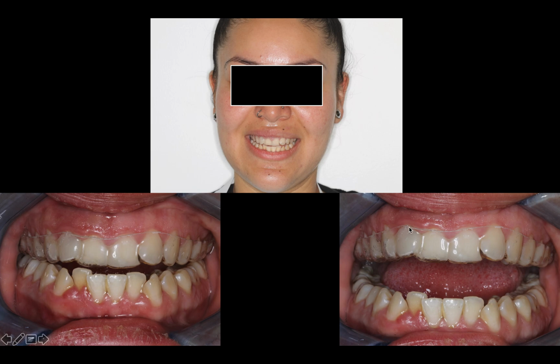I thought the shade was actually pretty spot on. We used actually B1 shade here. And if I was to do it again, I think that I cut it maybe a little bit too short. You can clearly see this line here.